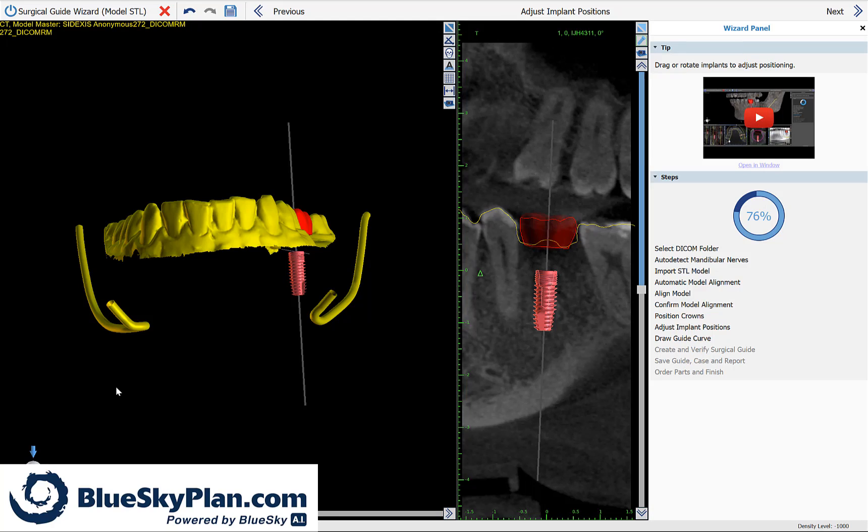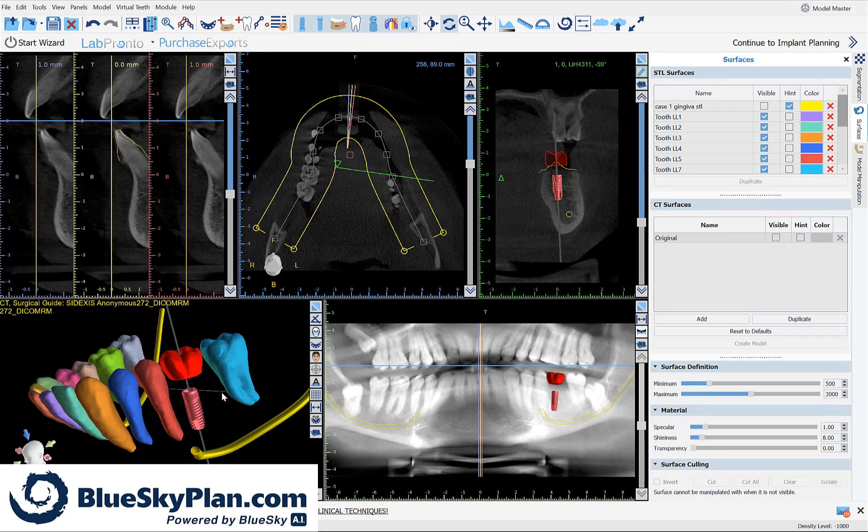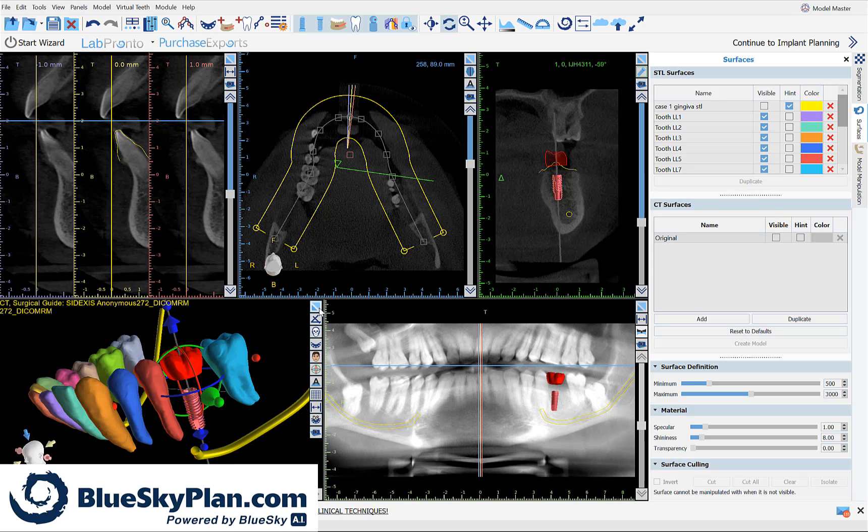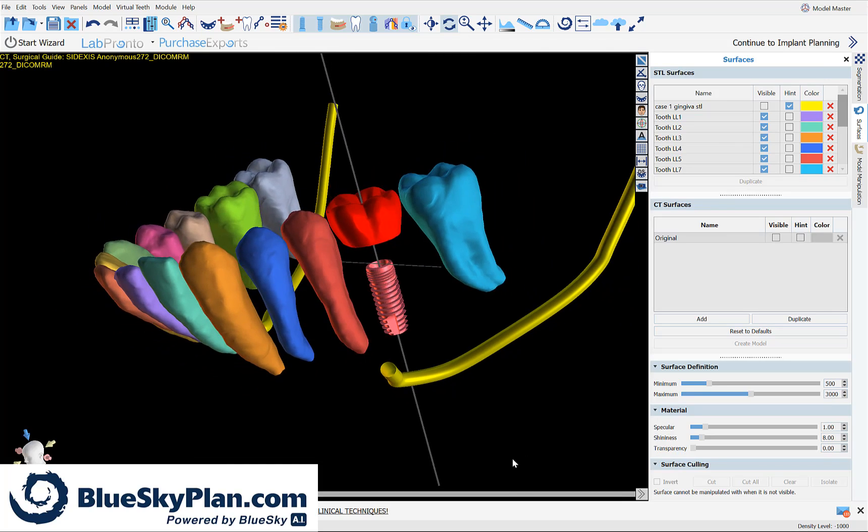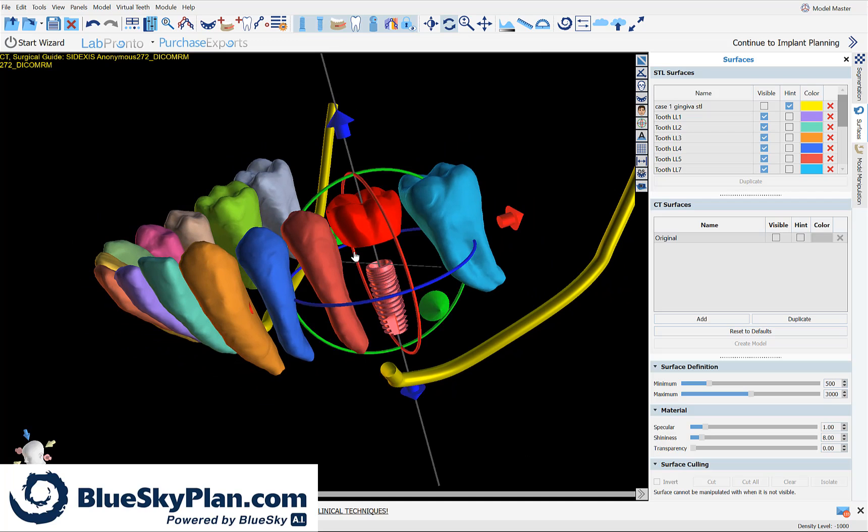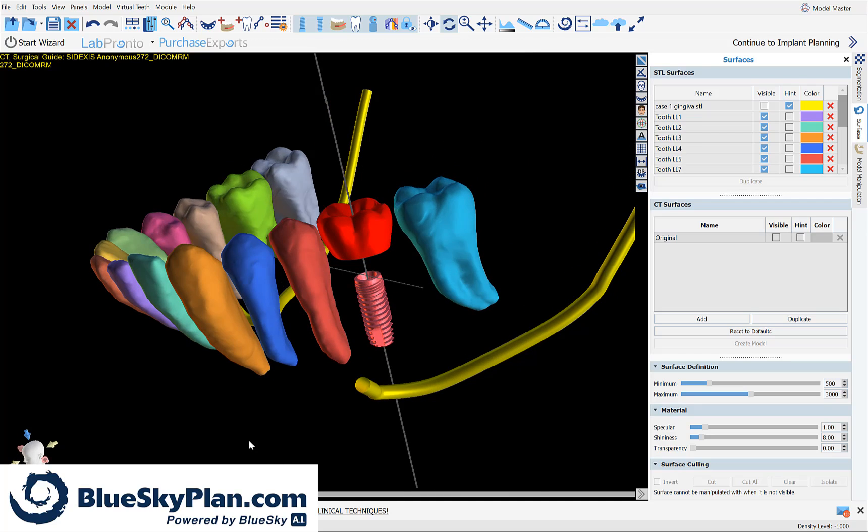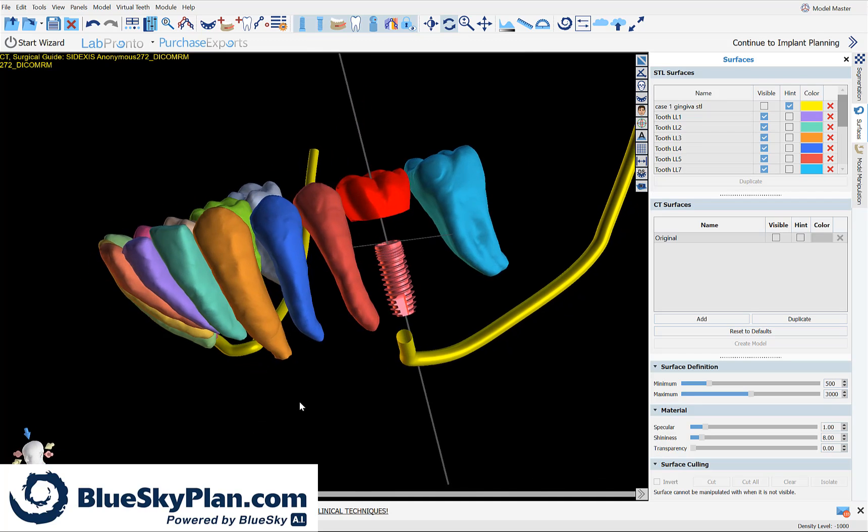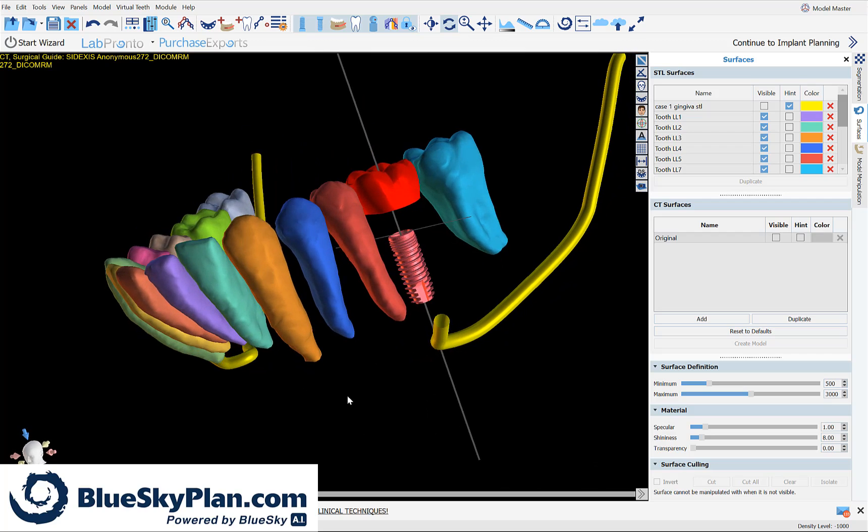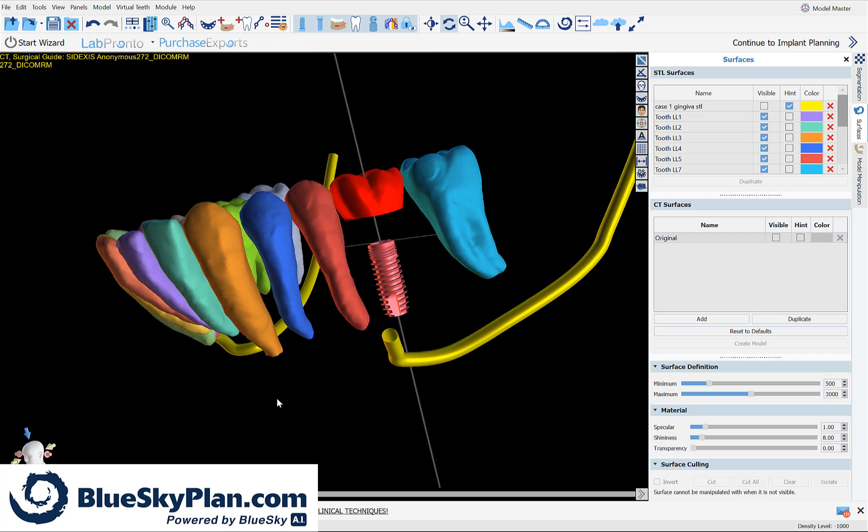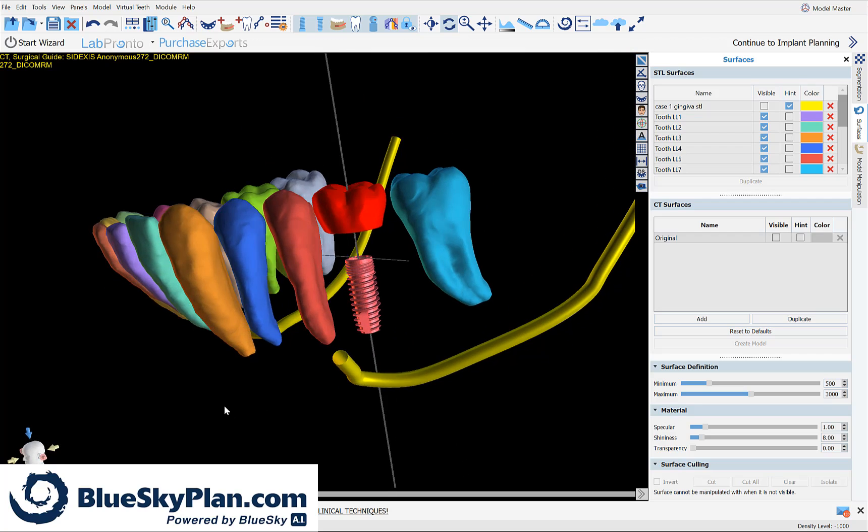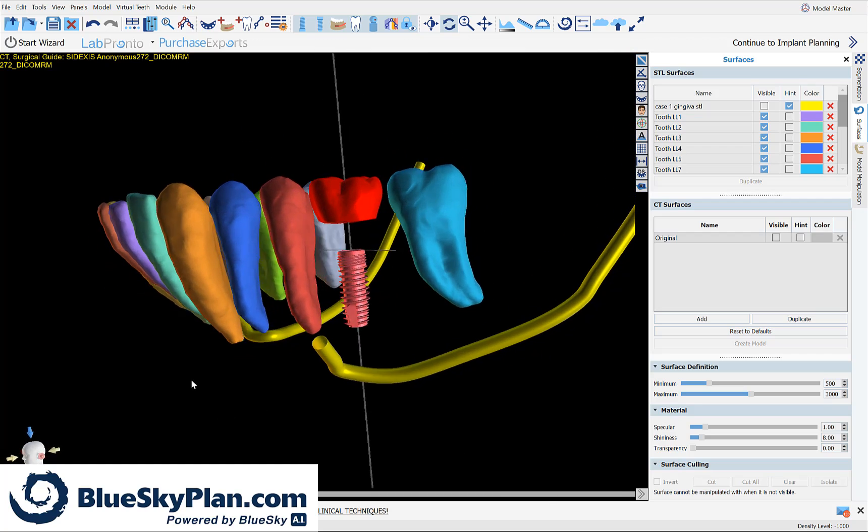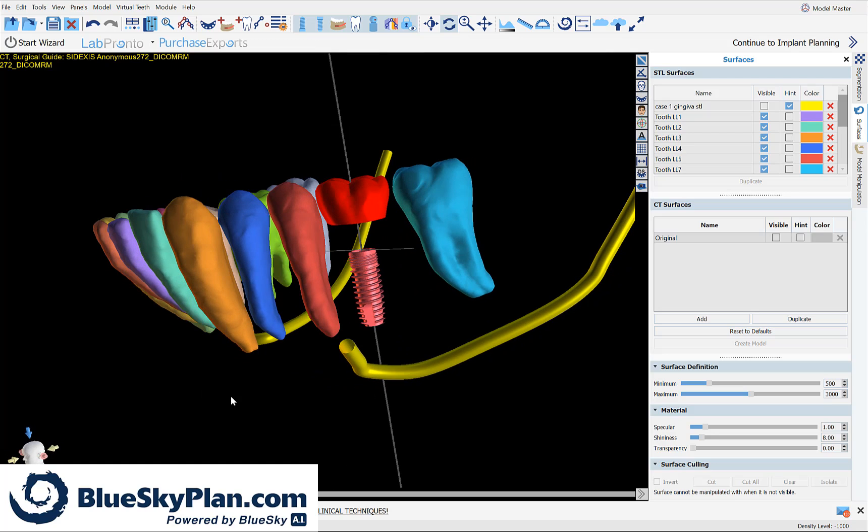I'm going to jump out of the wizard for a minute to demonstrate the implant accuracy and then we'll continue with the wizard process flow. Here we can see the results of the automatic implant placement, and we can view the accuracy in conjunction with viewing the automatic CT tooth segmentation.